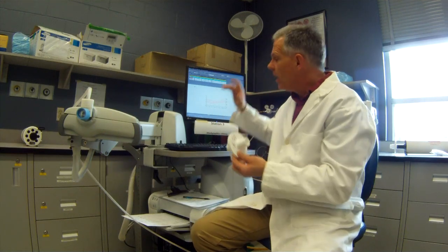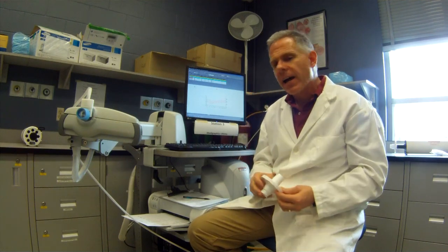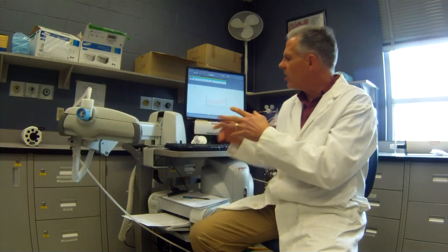We'll use the machine to time that for 12 seconds. So we want 12 seconds at maximal expiratory output, all right? So we start them off nice and easy, just getting used to sitting there, make sure they have a good seal, and then we'll coach them.